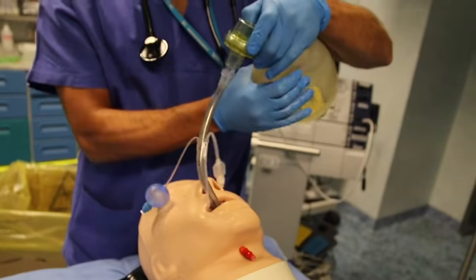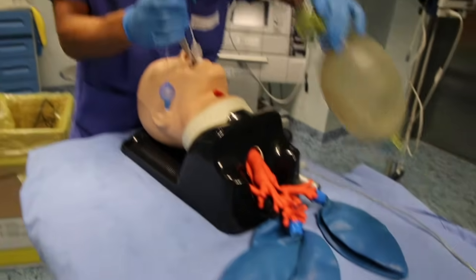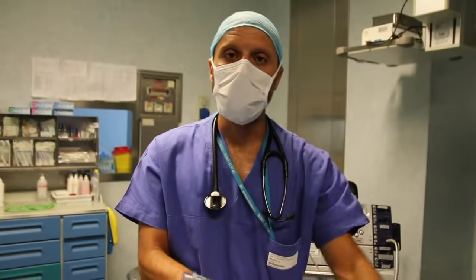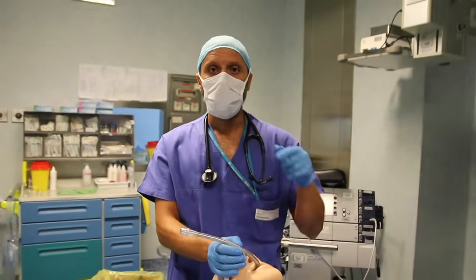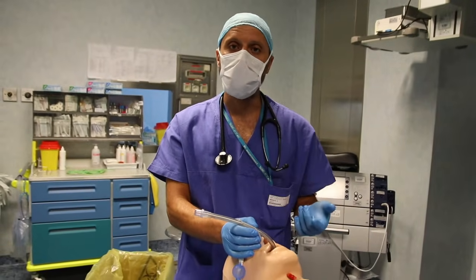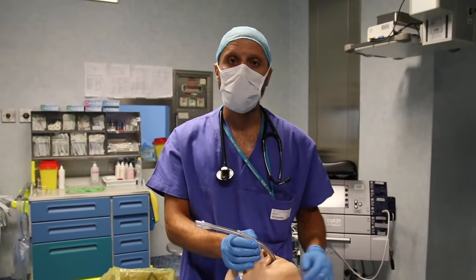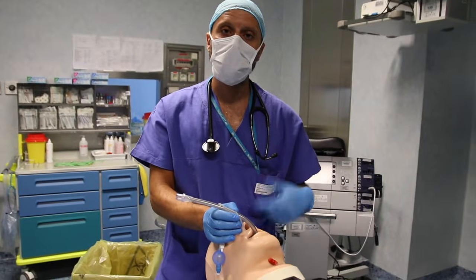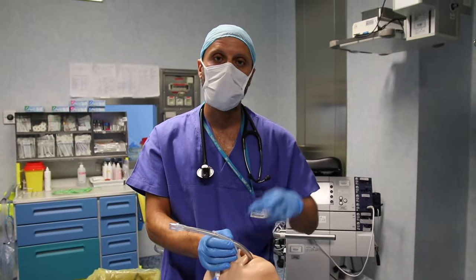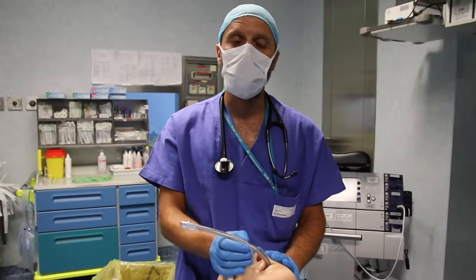Then start ventilating the patient. This is one of the main differences compared to other existing supraglottic airway devices, such as the laryngeal mask or laryngeal tube — the fact that the spritz tube, in order to be placed in case of difficulty, can benefit from visual assistance offered by a laryngoscope, simple or video type. So the insertion procedure gets easier and more straightforward, and most importantly, the risk of damaging the patient is reduced.